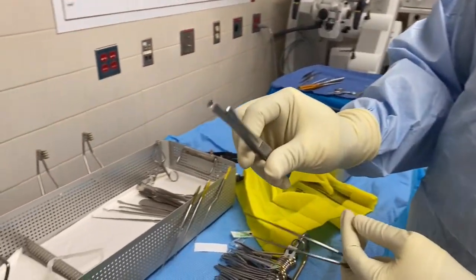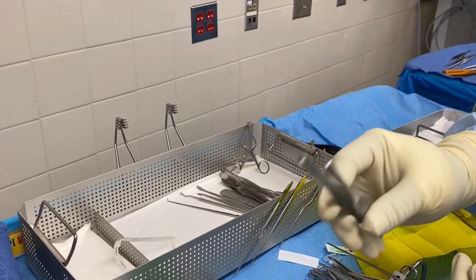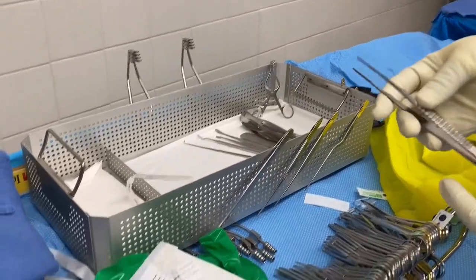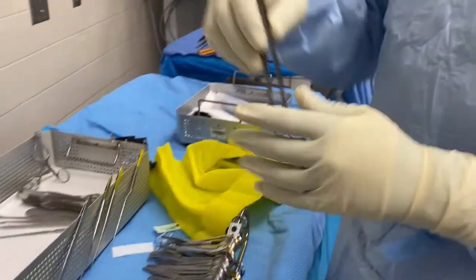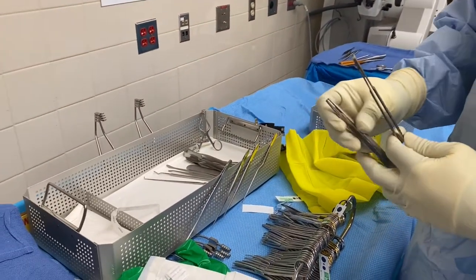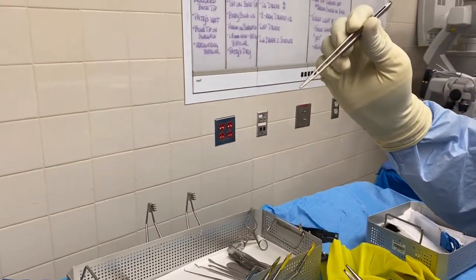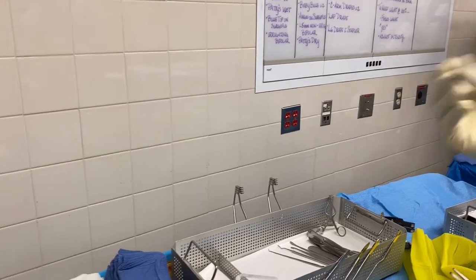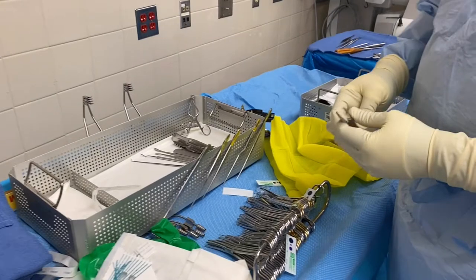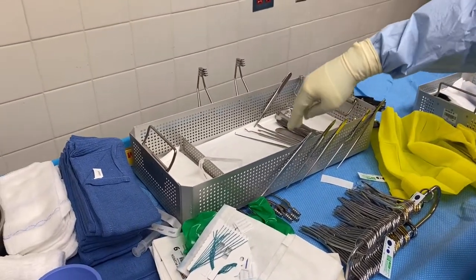This is a Russian forcep — some doctors use it to get tumor out, and some doctors even call it tumor forceps. This is a DeBakey forcep — at one place they called it a vascular forcep because vascular surgeons use it a lot. I'll keep all my teeth forceps together. Those are spoon forceps.